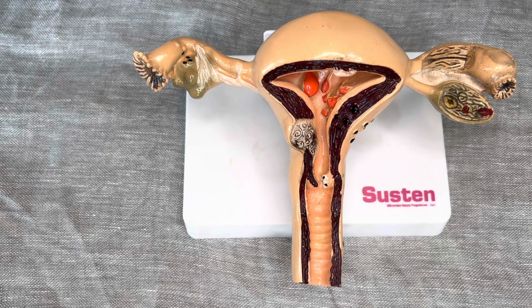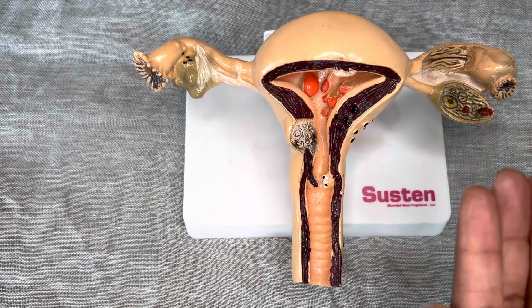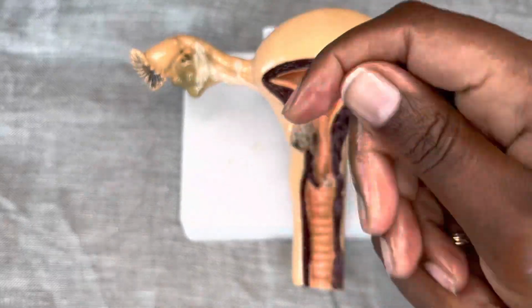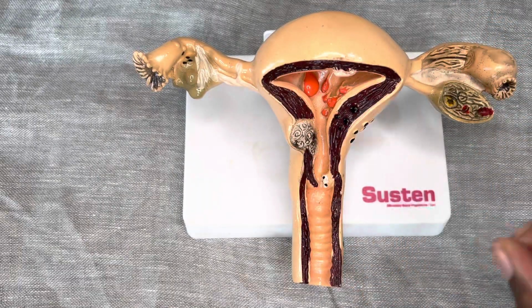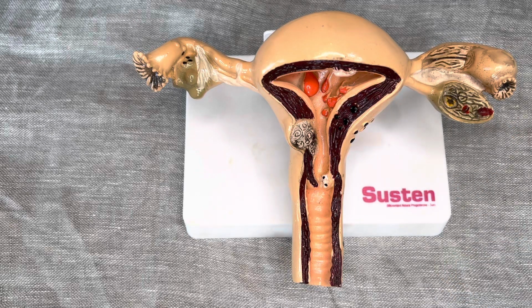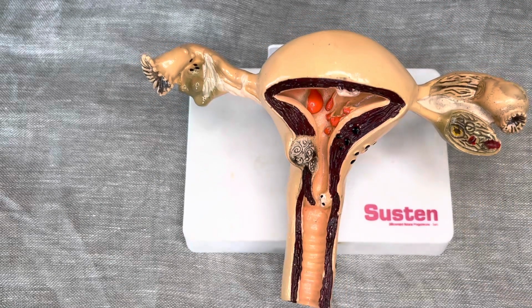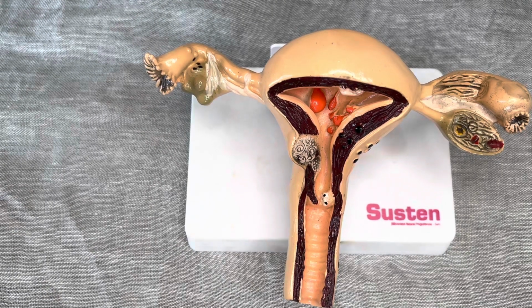This is supposed to be a very sterile procedure. Before you start the procedure, you're supposed to wash your hands, but for me in this case I'll just be sanitizing so that I show you the importance of it being a sterile procedure. So you first explain to the client what you're about to do, and you have them go on the table and sit, and then they lie down after you've taken their vitals and explained how the procedure goes and what you're expected to be doing today. Also explain that it's going to be a bit uncomfortable but definitely not painful, and then you proceed.